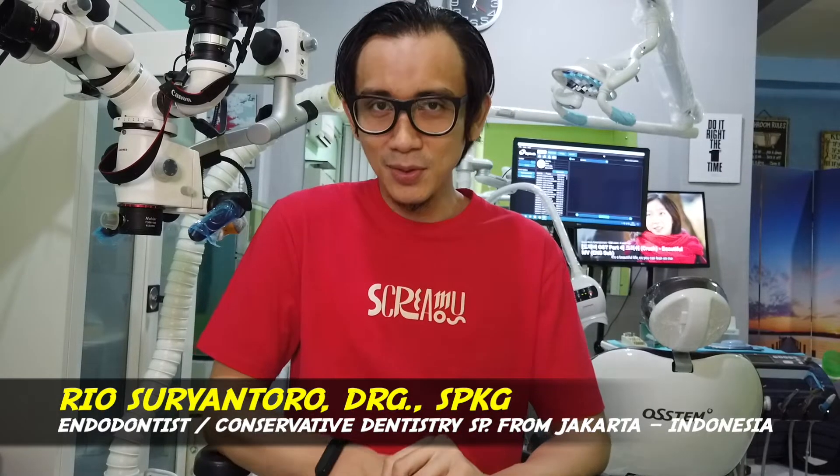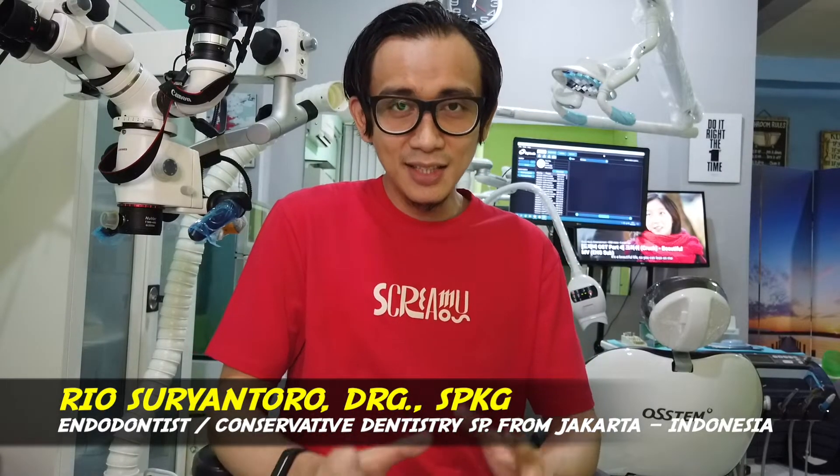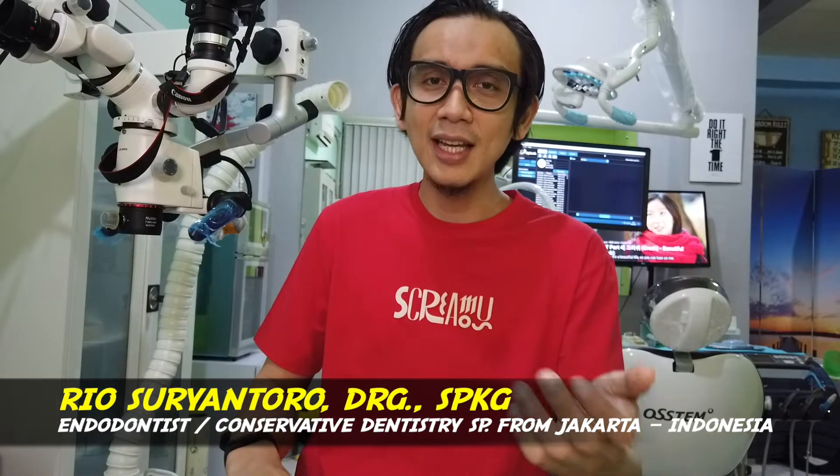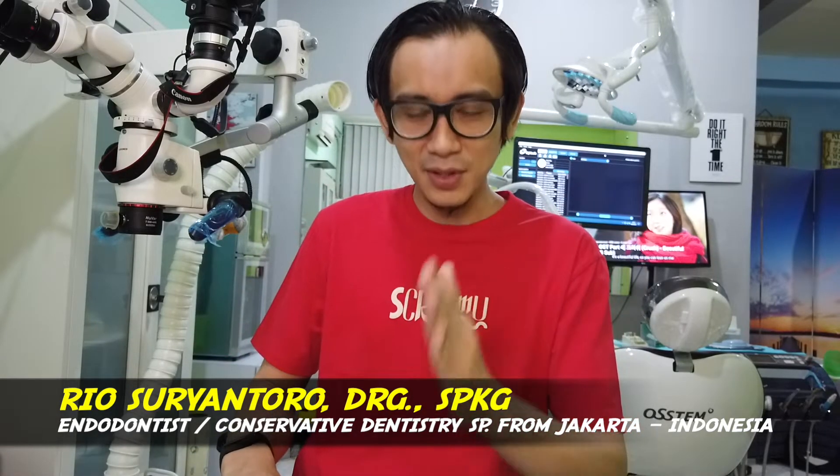Hi, good morning. My name is Sirio. I'm in the office from Jakarta. And in this video, I'm going to give you three examples on how to do a continuous active ultrasonic irrigation by using ultrasonic file, or we usually call it U-file, attached to the ultrasonic device. I use Ultramine from Active.